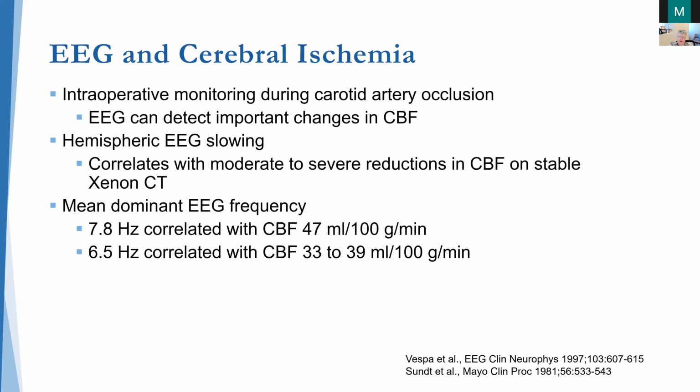And when the carotid was clamped, there was initially hemispheric EEG slowing, and this was found to correlate to moderate to severe reductions in cerebral blood flow on xenon CT scanning or perfusion CT.